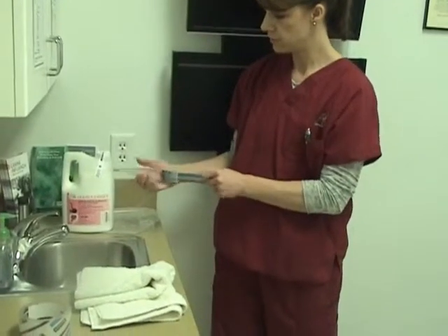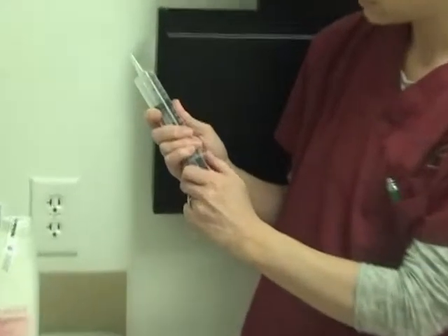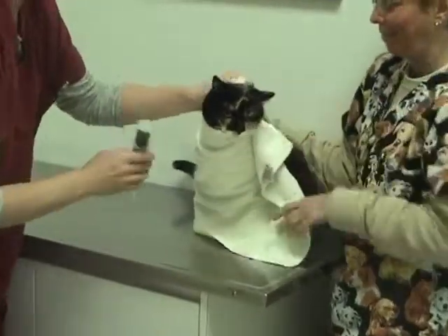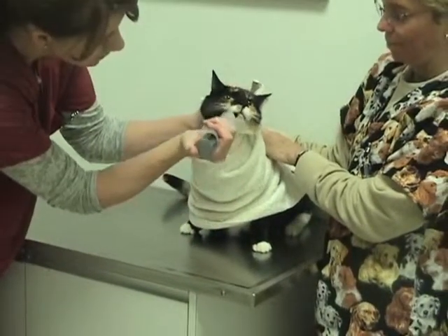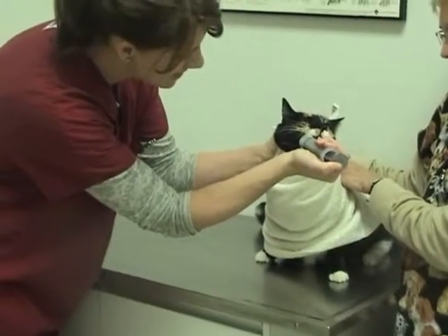Care needs to be taken to keep the pet clean, so we use a makeshift bib and wrap it around the animal. The barium is administered slowly by placing the syringe in the buccal pouch of the animal's mouth. Once all the barium has been administered, immediately take the animal back to X-ray for the first set of X-rays after contrast administration.